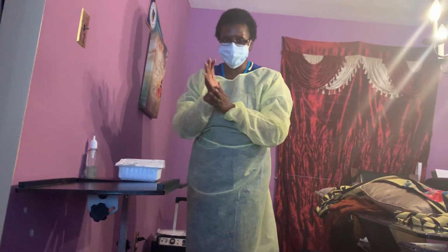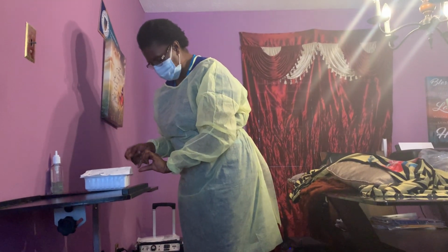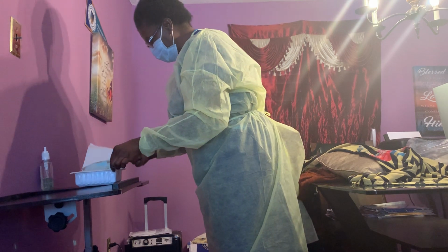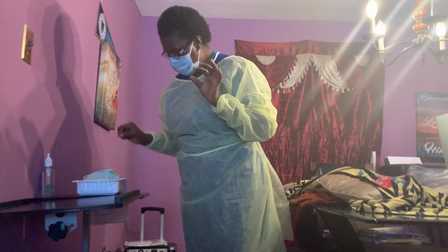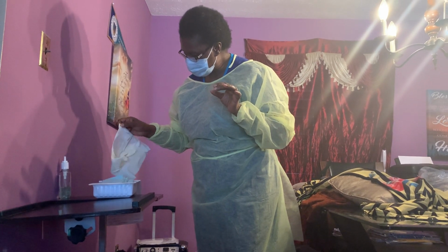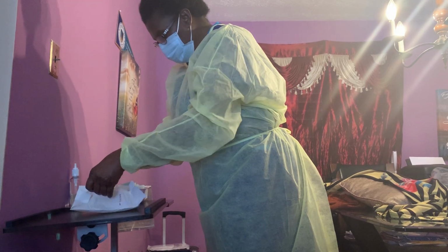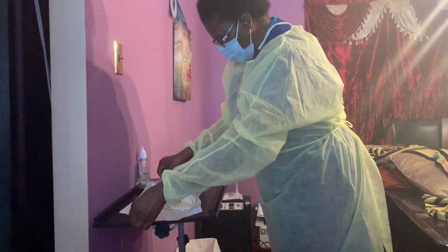So I'm gonna do hand hygiene, and then I'm gonna prepare my sterile field. So I'm gonna open from the dressing tray away from me, and then after that is away from me, I'm gonna take my sterile glove out first, just touching the border, and just put it, open it, make sure just touching that 1 inch area.